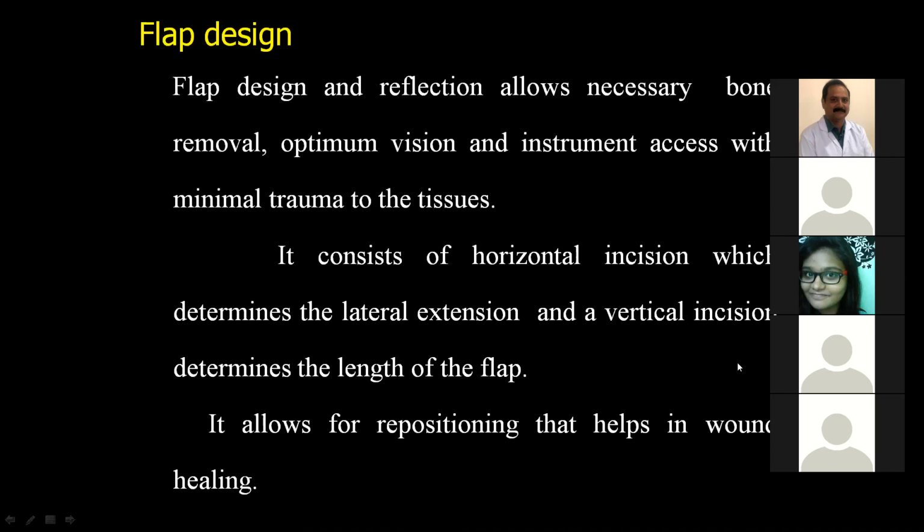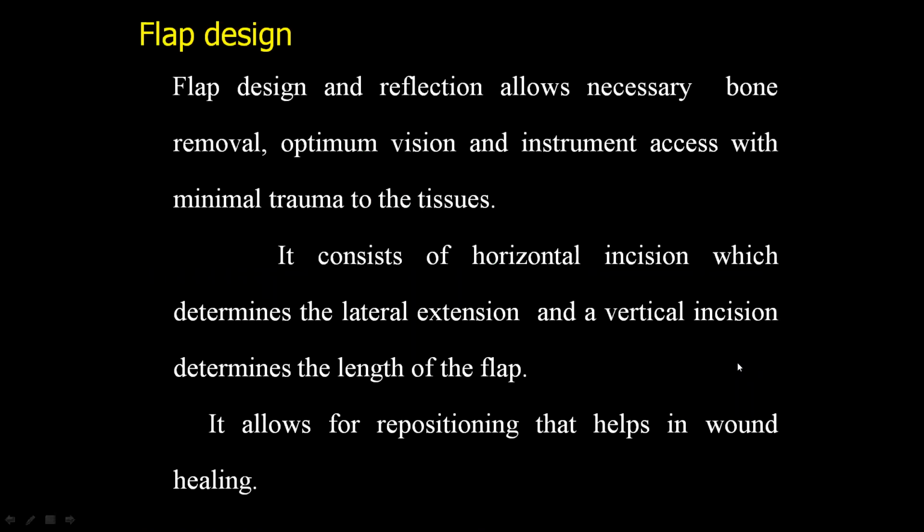Okay, so flap design should allow necessary bone removal, optimum vision, and instrument access with minimal trauma to the tissues. Any flap will have one horizontal incision and a vertical incision. Now it has been added with an intracrevicular incision. It allows for repositioning that helps in wound healing.